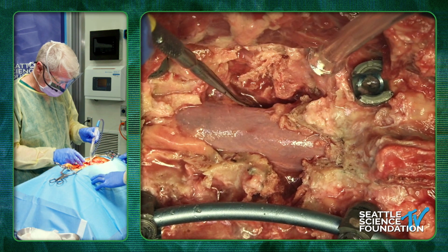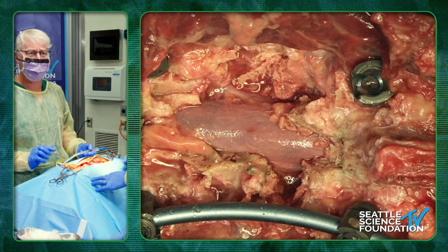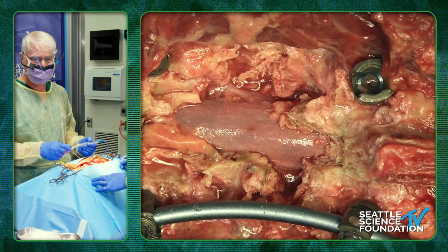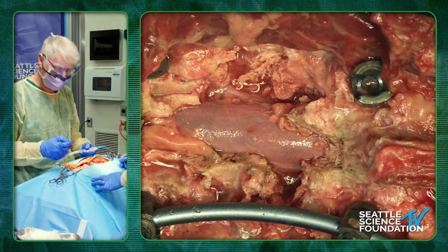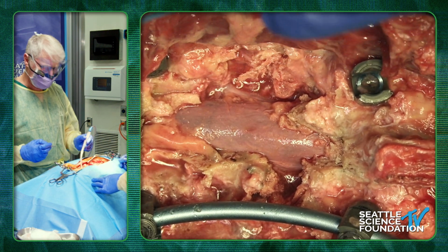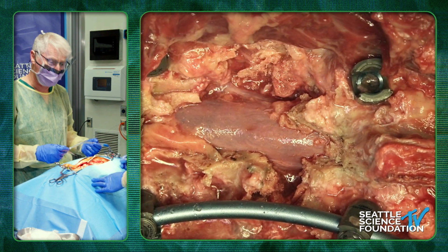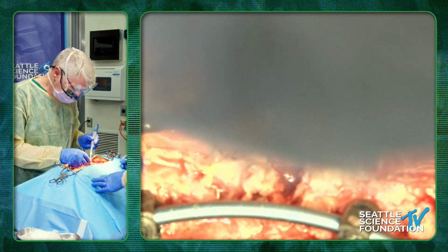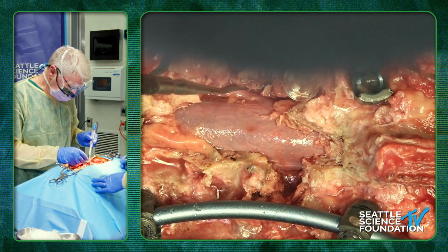Since you talk about that, Stephen, you do this under neuromonitoring, obviously. Yeah, it's all under neuromonitoring. And even more, for lumbar roots, we actually do direct nerve stimulation. If you take your probe and put it on the nerve root, it should stimulate at about 1 or 2 milliamps, and you can tell if the nerve is unhappy because it'll need more milliamps to get the same stimulation. So usually after every step, we would stimulate the nerve root for a lumbar root just to see what we have. And you can see here is the nerve root and then the dorsal root ganglion over there.